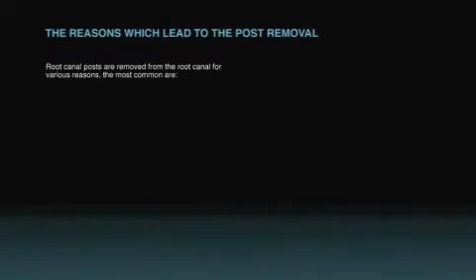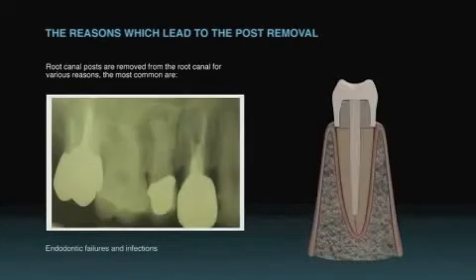Root canal posts are removed from the root canal for various reasons. The most common are endodontic failures and infections.